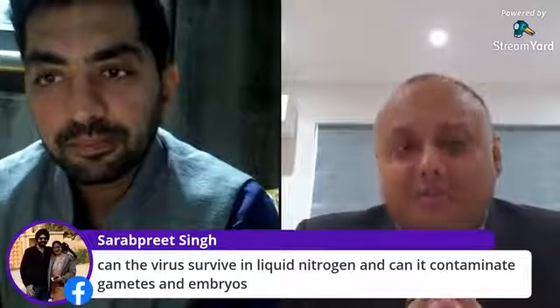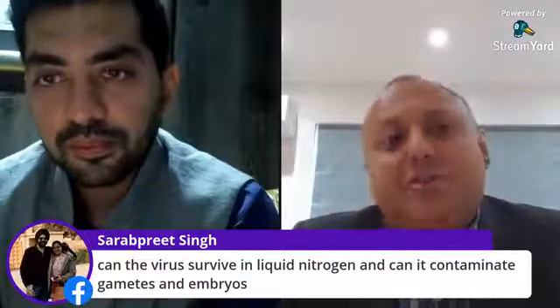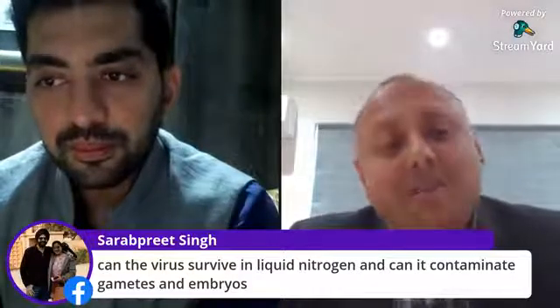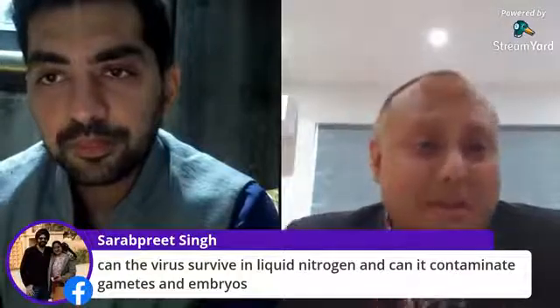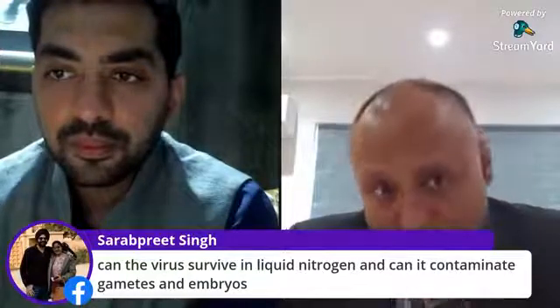In my opinion, if you're comfortable using a closed system, I'm not saying universally change your vitrification protocol, because you need to validate it, of course. We are going to be using Rapid-i in our lab because I'm quite comfortable with the Rapid-i system, only for the patients who are symptomatic or COVID positive.